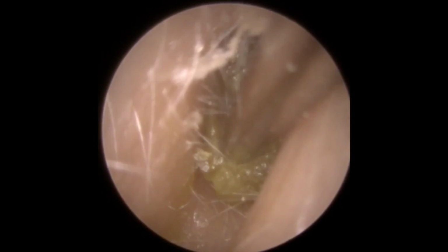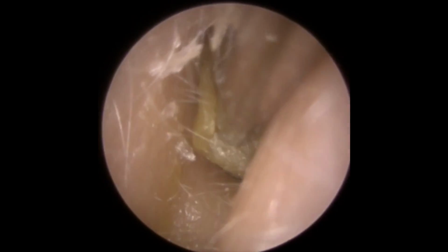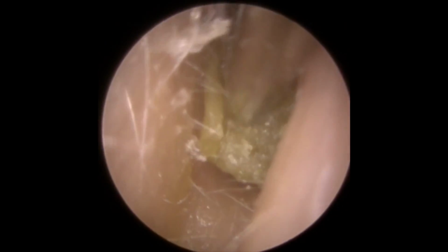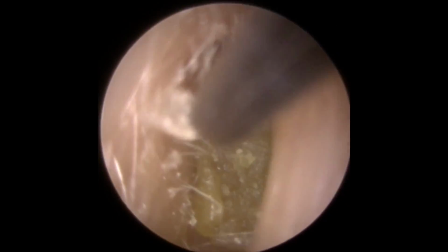The other thing that happens is you can't put too much pressure on it from the front because it pushes the wax further in, which is then going to cause you a problem. So you then have to hold on to it, try and bring it back to the front, wedge it so you've got enough force to break this off. So when you take all that into account, you can see why this lady was having to go to the ear, nose and throat specialist to get this done, because a lot of them have obviously quite specialized tools to do this. We have certain specialized tools, and I was confident that we could get this out.